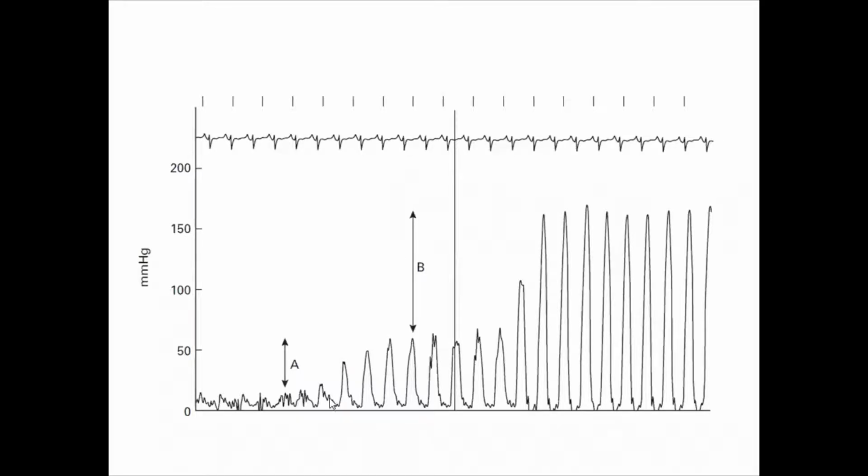Let me continue. If I want to describe this, I will say this is a hemodynamic tracing during withdrawal from the pulmonary artery to the RV, with ECG in sinus rhythm. The pulmonary artery pressure is around 25 over 5, something like this. Then from the pulmonary artery, it seems that we are in the RVOT. There is a gradient between the pulmonary artery and the RVOT.